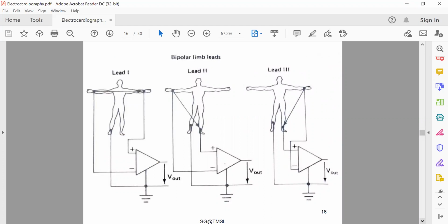Four electrodes are generally used to record the ECG. The electrode on the right leg is only for ground reference, because the input of the ECG recorder has only two terminals. A particular selection can be made among the available active electrodes.